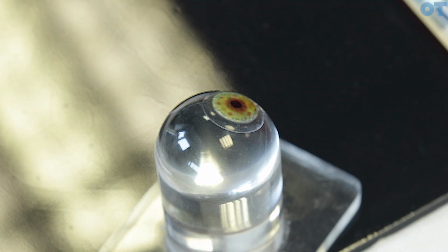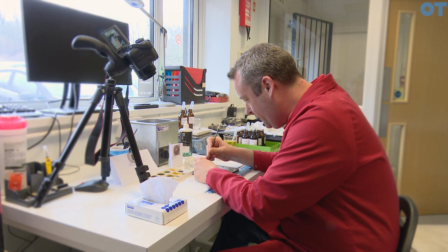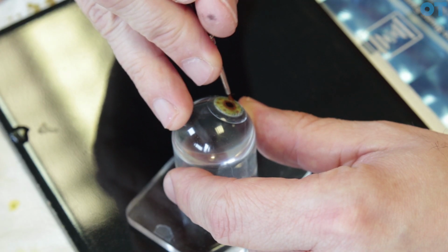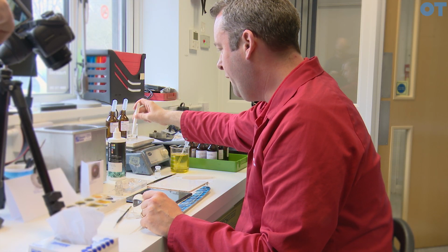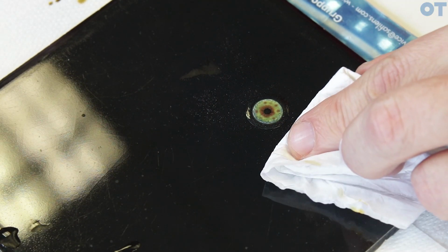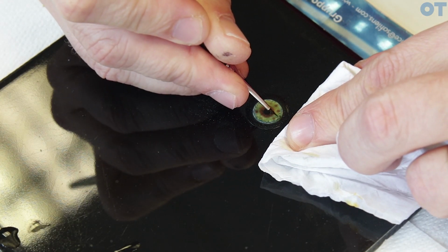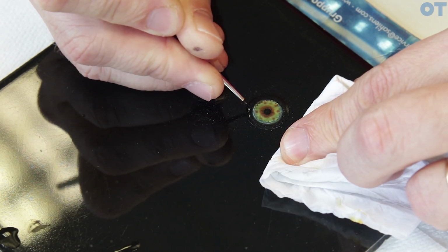You might want to emphasise any particular features that the eye has as well. Like this one has speckles dotted around the iris area. Okay, for the next bit I have to flatten this out onto a plate just to check the edges and how it's looking on the background. Find yourself holding your breath when you're doing all the little details, just stop breathing.